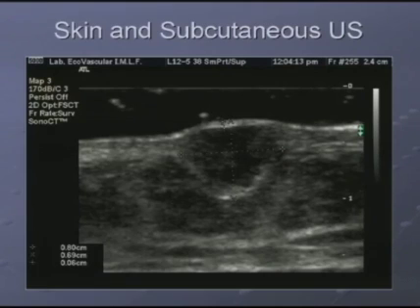Let's see some clinical examples of the applications of near-field ultrasound. This hypoechogenic image here corresponds to breast metastasis in the skin. We are working here with 12 megahertz, and we are using gel as an acoustic window or as an acoustic pathway.